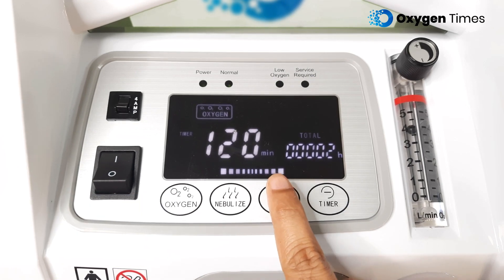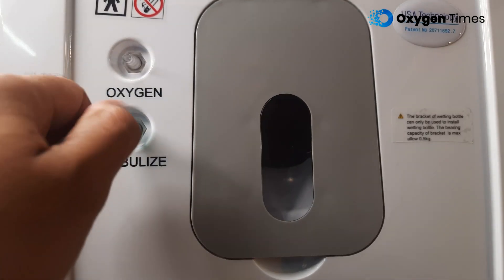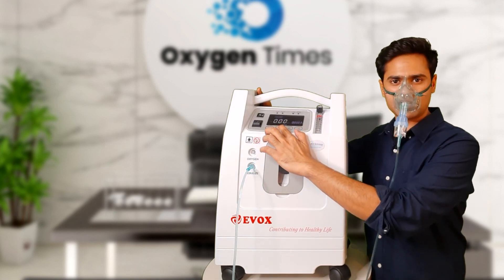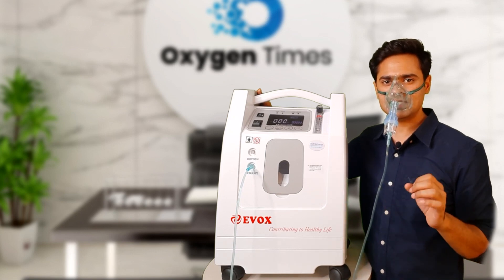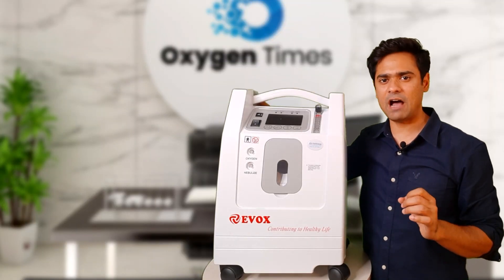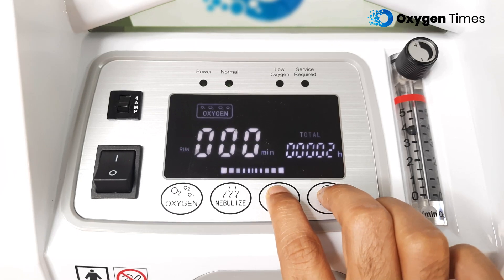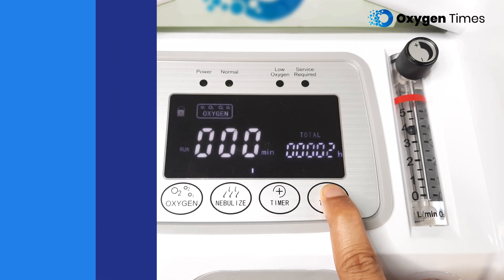You can access, adjust, and activate Oxygen Level, Nebulizer, and Timer from the front panel of the device. The machine comes with a nebulizer mask which can be connected to the nebulizer outlet. You can activate it from the touch panel button and the LED screen will display its icon. This is an added benefit for many patients with COPD, Asthma, or other lung disorders. The machine also has a child lock feature — to activate it, just long press the Timer plus button, and to deactivate it, long press the Timer minus button again.